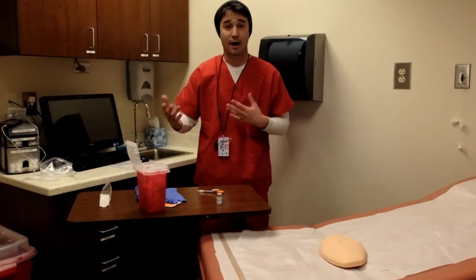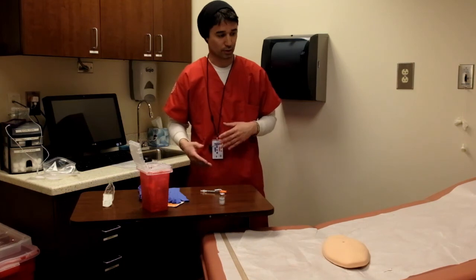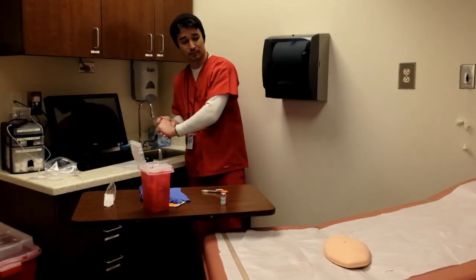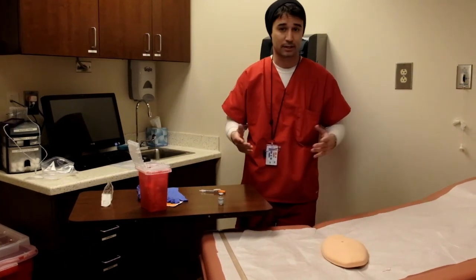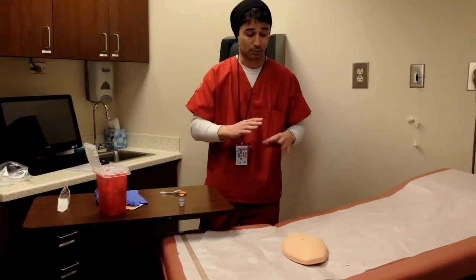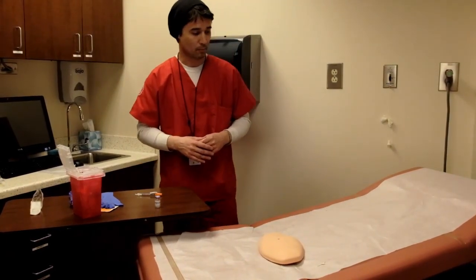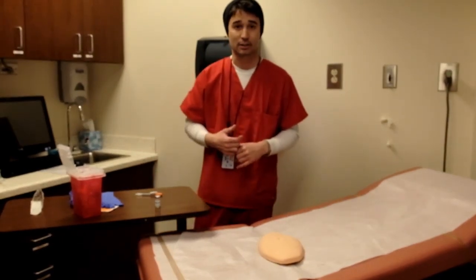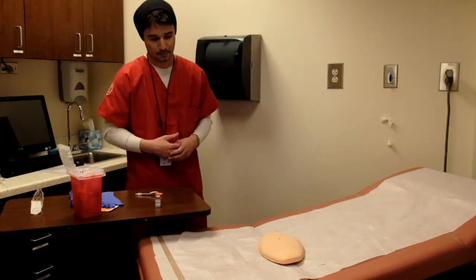Okay, folks. After we have drawn our medication into the syringe, we're going back into the patient's room. We practice our hand hygiene, adhere to the principles of aseptic technique, and make sure we check the 7 rights of medication. We'll also ask the patient if they have any hypersensitivities to the medication that's going to be given. We don't want any odd allergic reactions that could possibly happen.